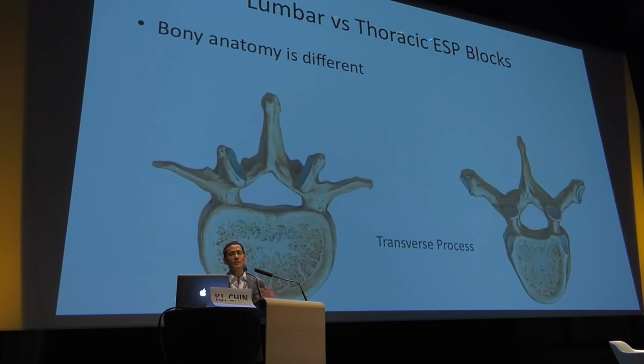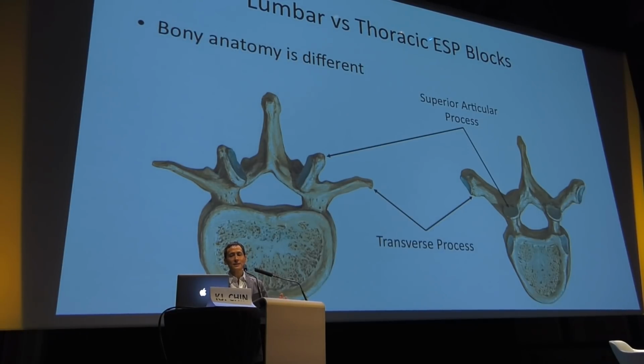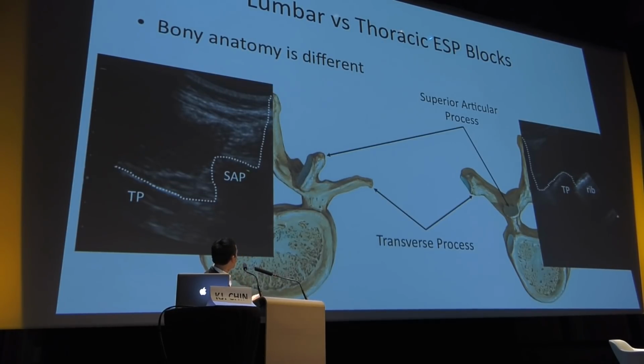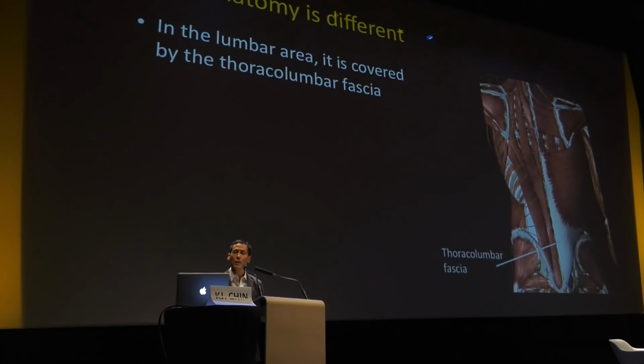And it's worth noting that there are some differences depending whether you do these blocks at the thoracic level or the lumbar level, because the bony anatomy of the vertebrae is actually different. So you'll see here that the superior articular process is a much more prominent structure in the lumbar area. So number one, when you're looking at it with ultrasound, the patterns are going to be different. You're not going to see just the transverse process tip. You're now going to see one more process jutting out, and then a deeper transverse process. And it's important to be aware of that.